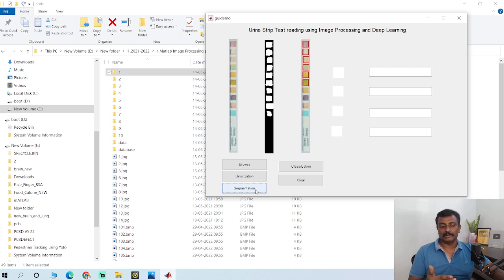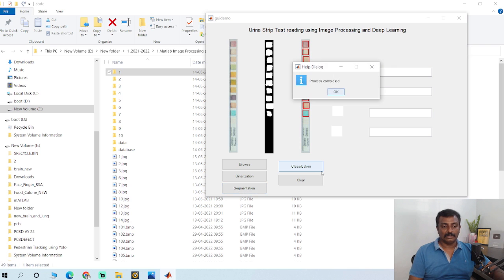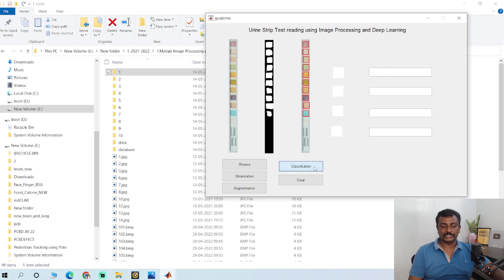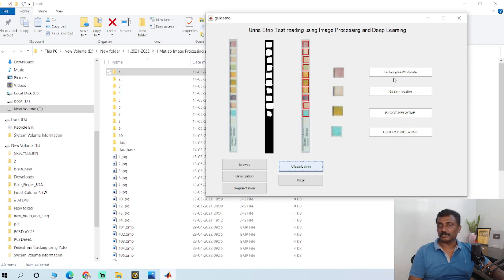Once the strip is done, click classification to classify the class. The output will be displayed here: leukocytes moderate, blood negative, and glucose negative.